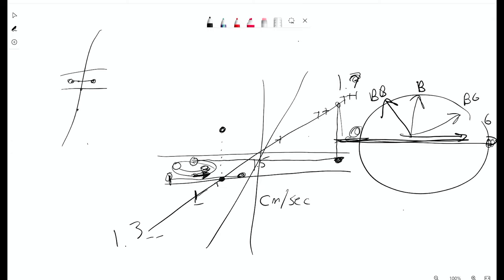So dark blood is typically a high resolution turbo spin echo sequence. Right. The same thing we're using for morphology in the heart. So we're using an additional inversion to be able to make the blood, no matter what, be super dark against the vessel wall. Contrast, right? Yeah, for sure. What's been nice is, of course, 3D imaging, right? So CUBE and things like that. Those techniques are based off fast spin echo sequences. The physics behind that is really rad.